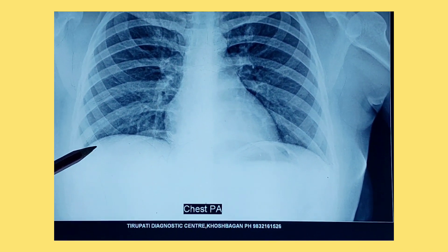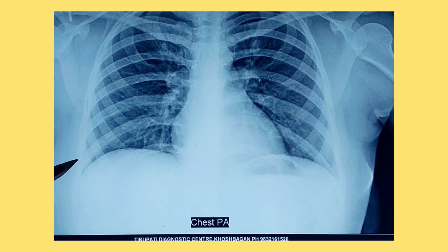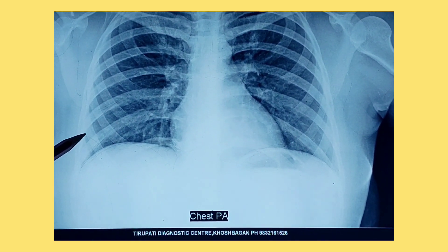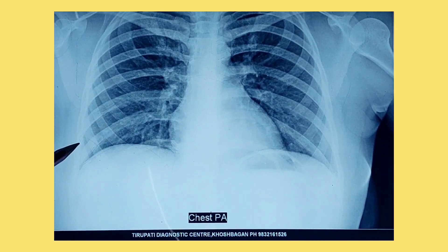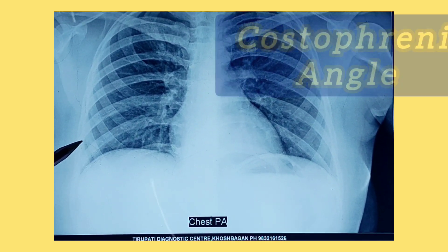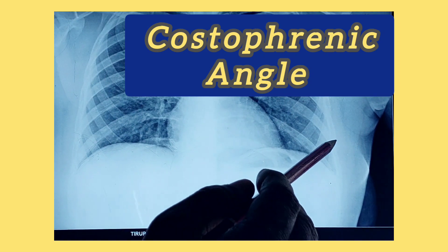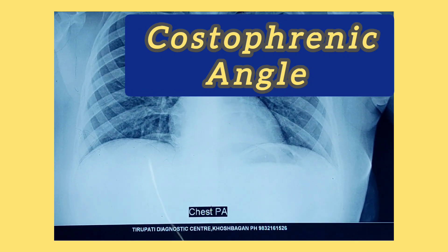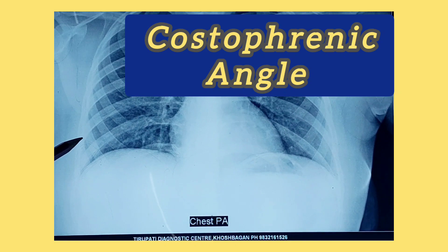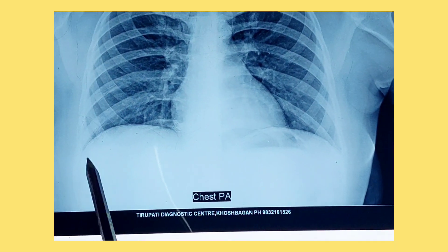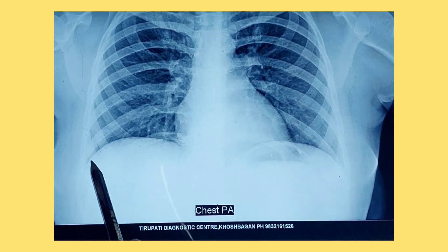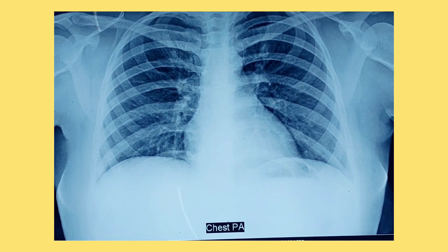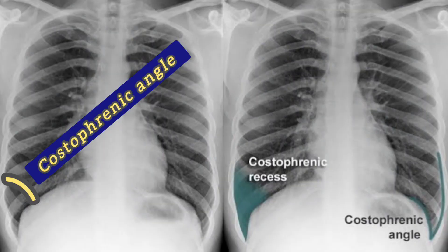Another angle is also present. This is the ribs and this is the diaphragm — so this is the costophrenic angle. The costophrenic angle on this side and the costophrenic angle on this side may be obliterated due to accumulation of fluid in the case of pleural effusion. This is the importance of the costophrenic angle.